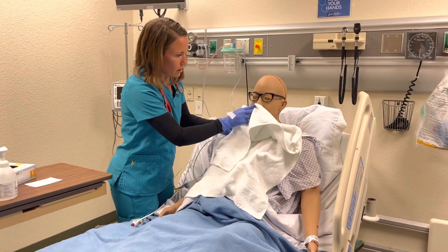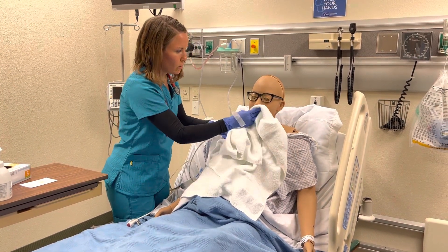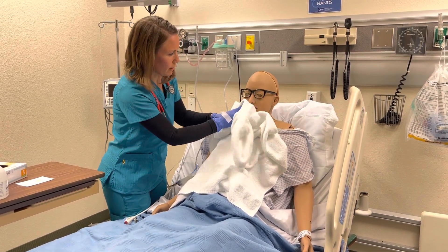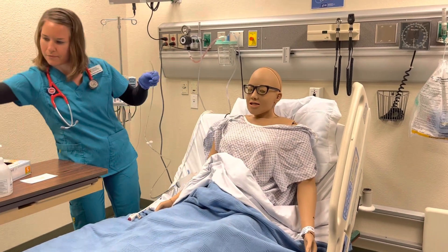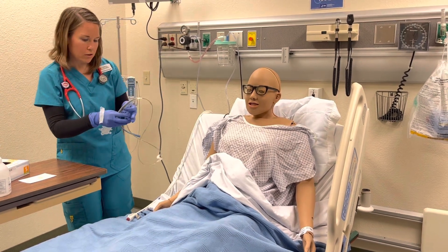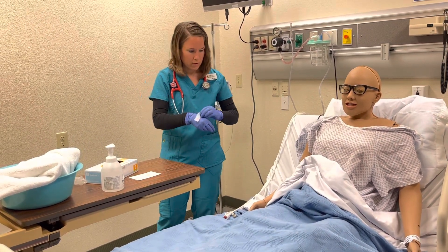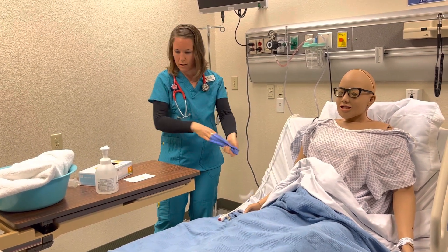I'm going to use this to do a little nasal care and a little oral care there too, and get you dried off. We'll dispose of the NG tube according to the facility policy — in this case just disposing of it in the trash. I'm also going to take off my gloves and wash my hands.